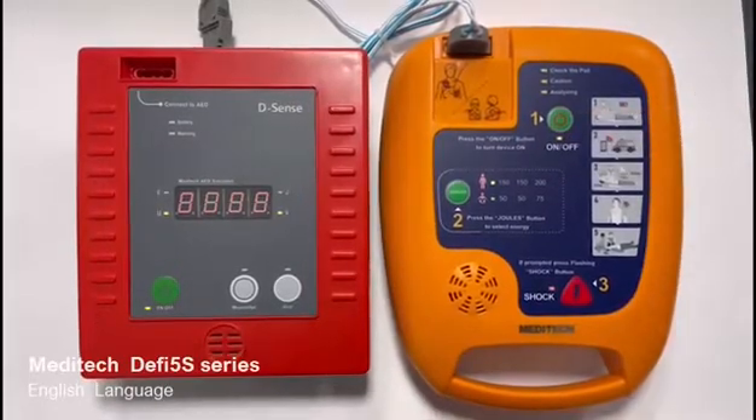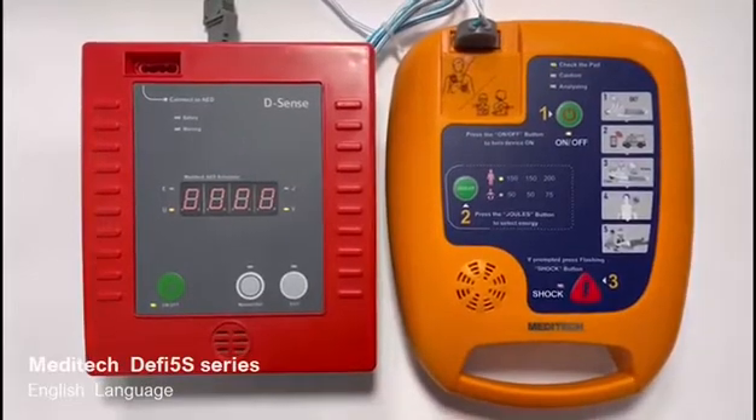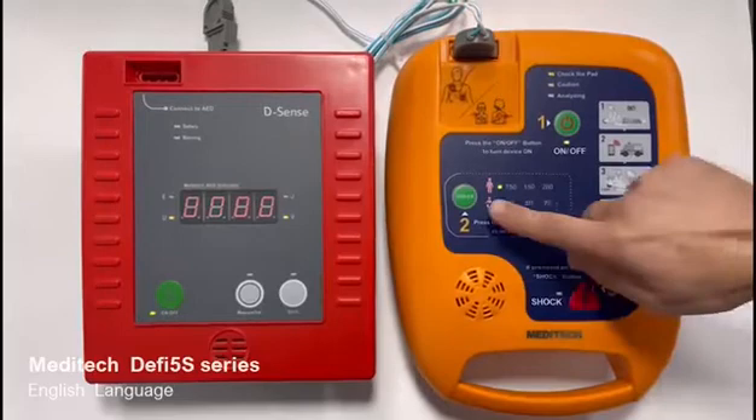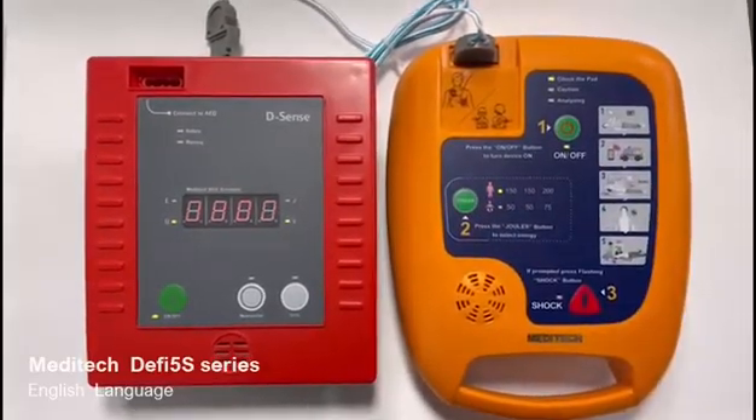System okay. Attach pads to patient's bare chest. Pediatric mode. Adult mode. Plug in pads connector.